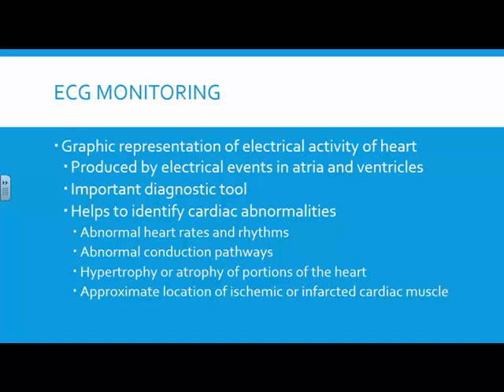A cardiac monitor can tell you several things. It can tell you heart rate. It can show you how good the electrical system looks in the heart. It can show you what the electrical activity of the atria looks like, ventricles.